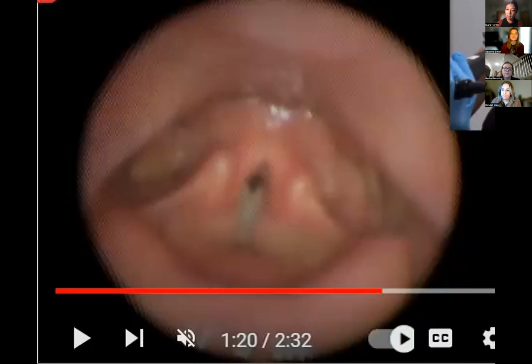Hi, so I'm the patient. I'm Kiara, and I have a couple of questions for you. So why can't we see the esophagus?